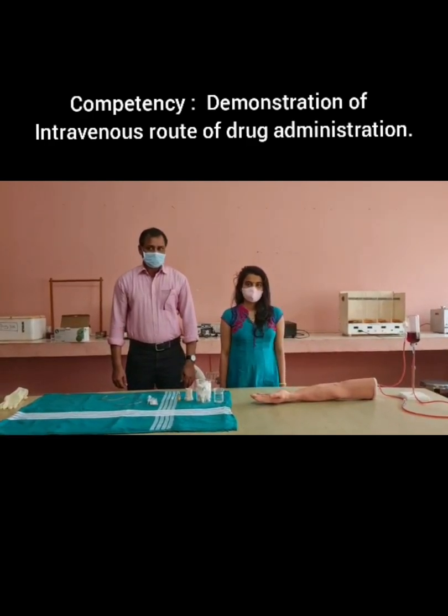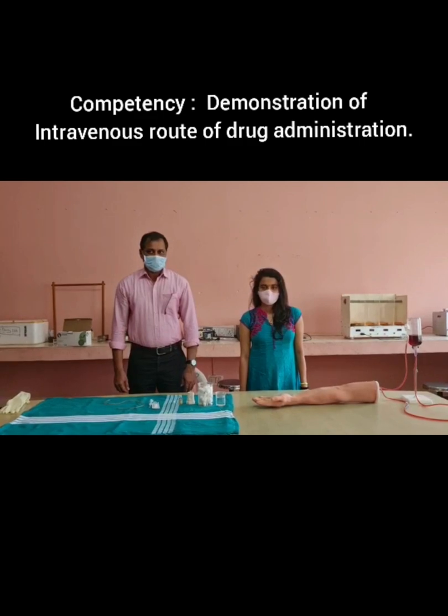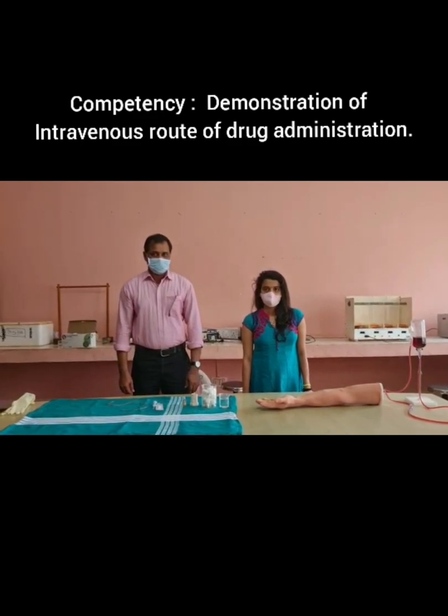Competency is demonstrating the technique of intravenous route of drug administration.